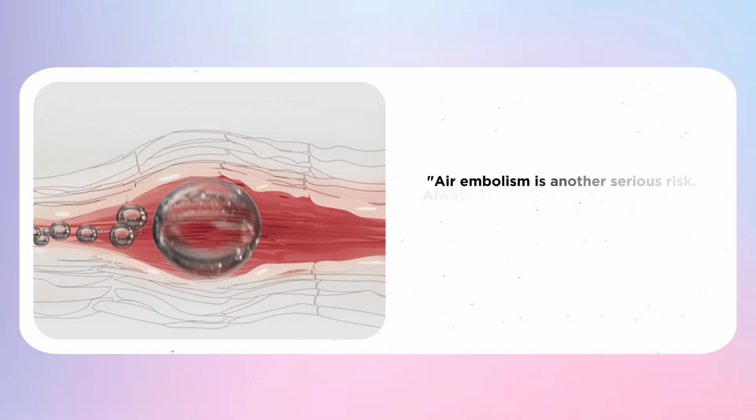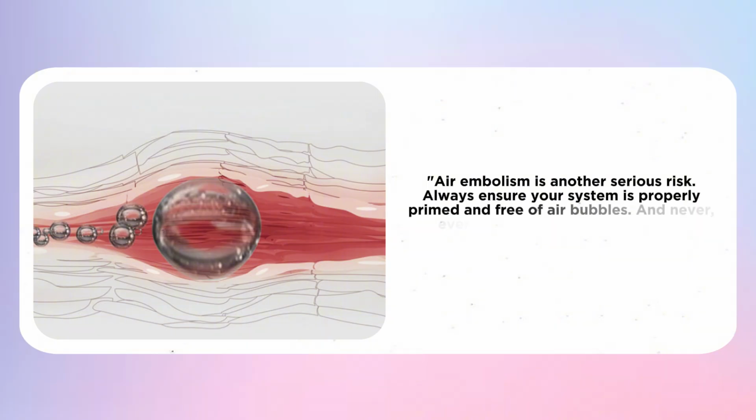Air embolism is another serious risk. Always ensure your system is properly primed and free of air bubbles, and never, ever inject air into an arterial line.